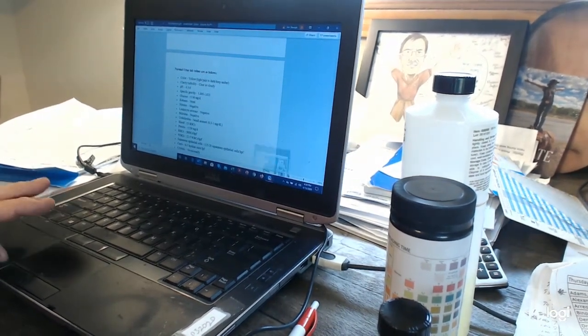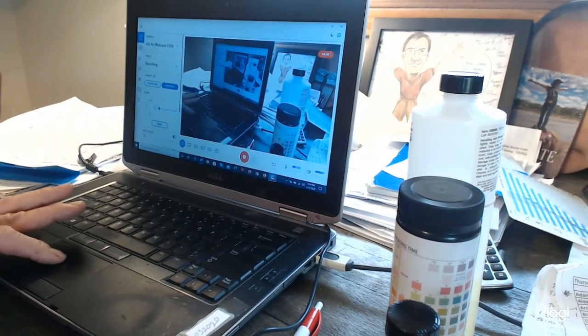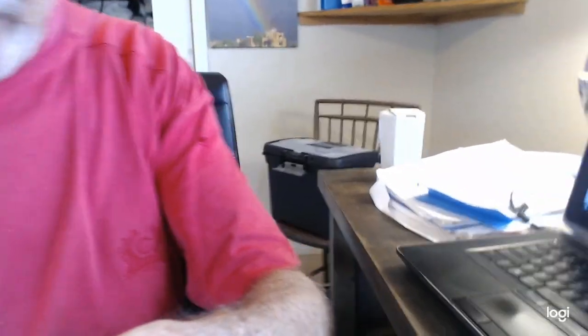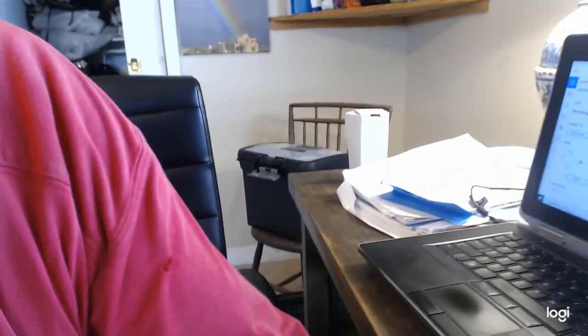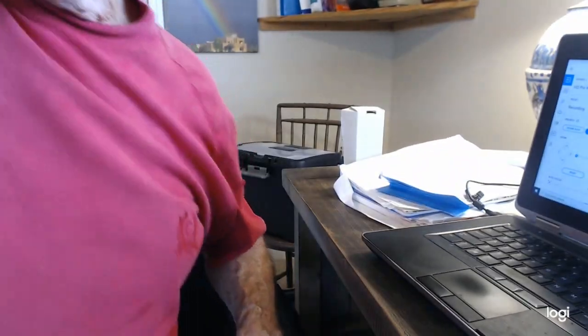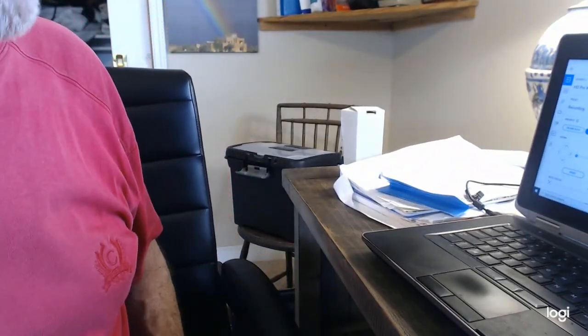Okay, so let's click back on here. And I'm going to put this back. Now see if I can actually, okay, that's sort of stable. I've got wind coming in. It might blow it over.